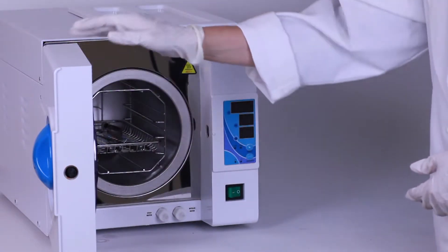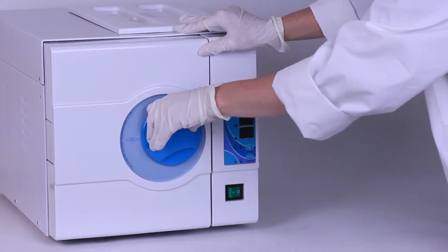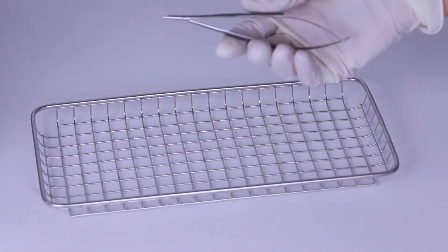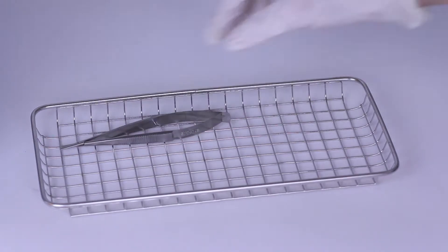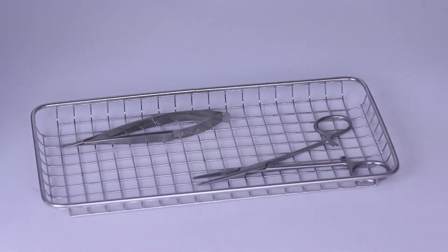Disposable paper or plastic pouches are ideal for autoclaving individual instruments. The instrument needs to be sterilized in an open, unlocked position. Locking an instrument prevents steam from reaching and sterilizing all the surfaces.